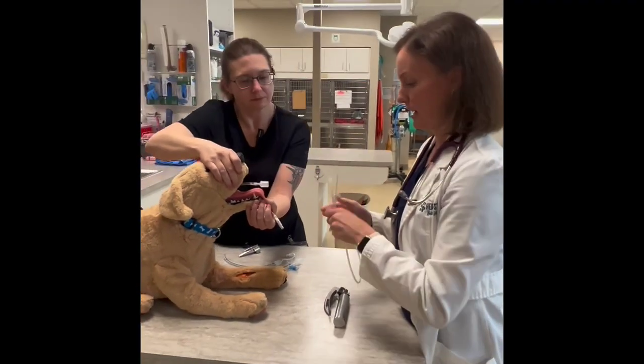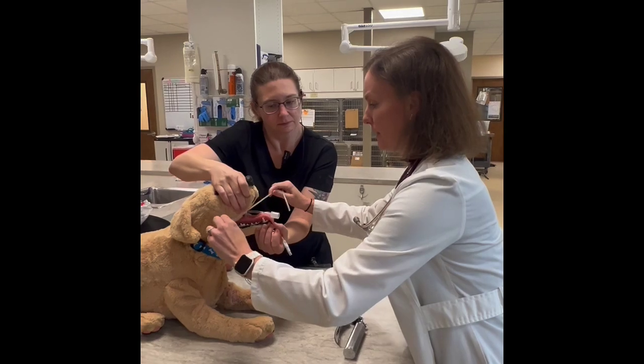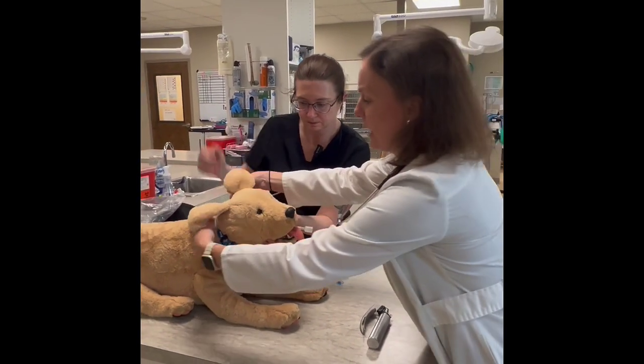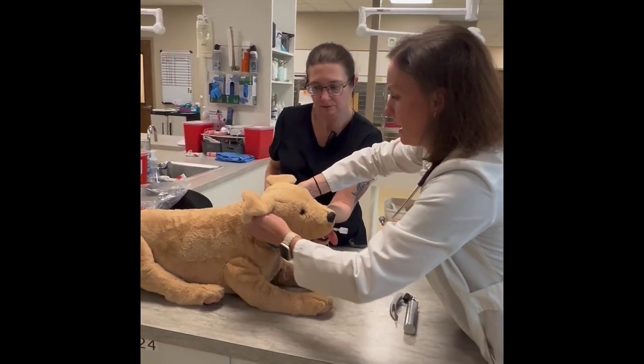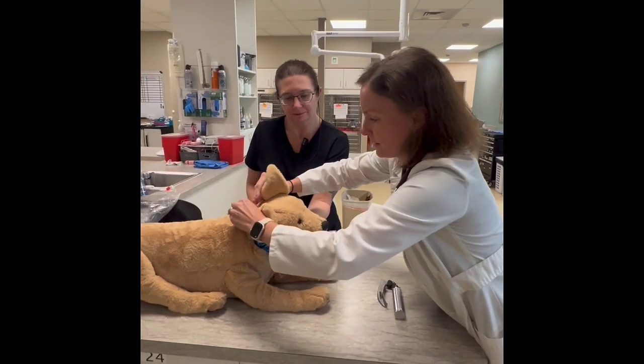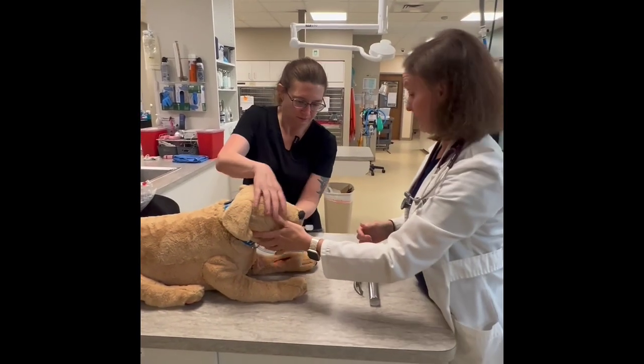You're going to place your tie — make sure you don't get that little tube in there. You can either tie it around his nose or the back of the head. On this dog we've got enough room that we can do the back of the head, and that's better anyway, especially if you're doing something like a dental.